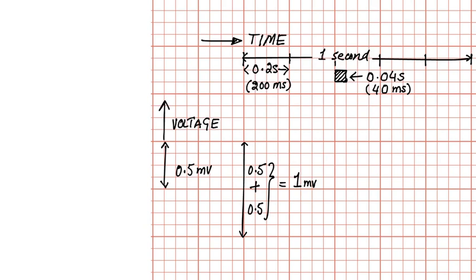That tells you whether the voltage strength is correct in the EKG, or whether the leads are misplaced and the voltage is higher for some reason, or whether there is a problem with the heart and the electrical current is higher, for example hypertrophy or the heart being near the chest wall and so on. So just remember, two big boxes make 1 millivolt.